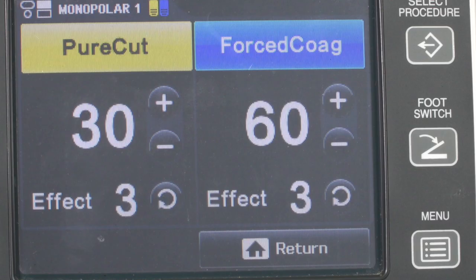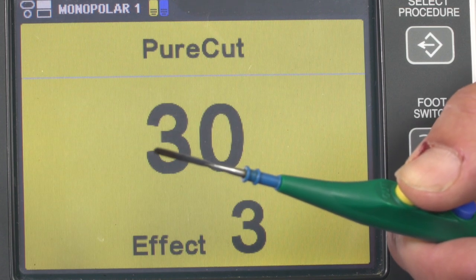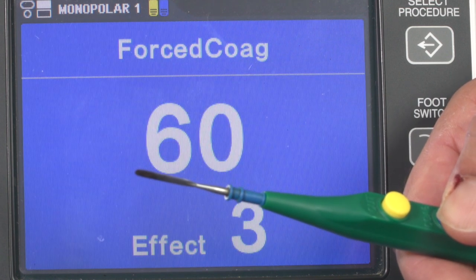Most electrosurgical instruments use manual activation. You can still assign a foot switch even though your instrument has hand activation. If you press the yellow button on the hand switch, the corresponding area on the screen lights up yellow; if you press the blue button, the corresponding area lights up blue. To adjust the volume of the activation signal, use the black dial on the back of the generator. For safety reasons, the volume of the error message is preset and cannot be changed.